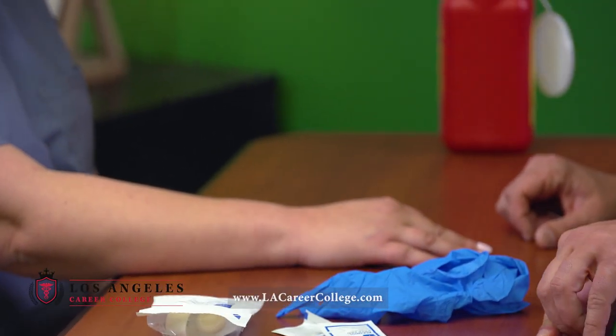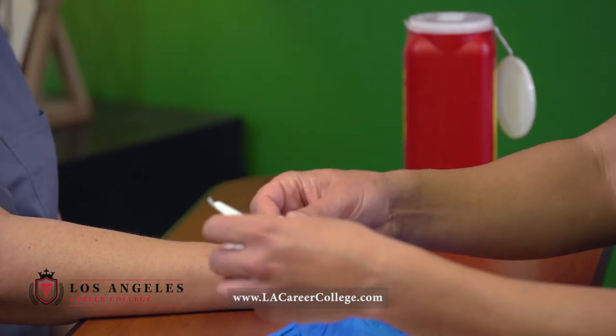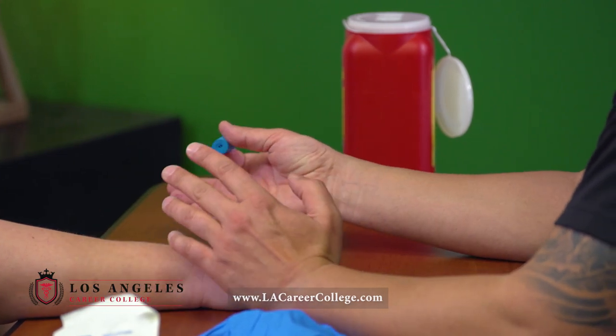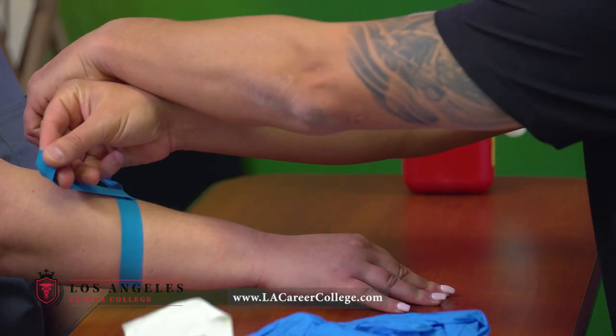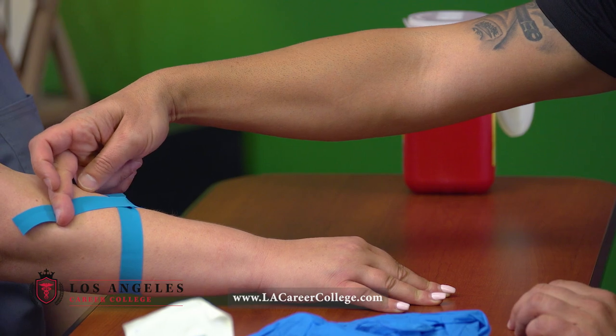So at this point in time, what I'm gonna do is I'm gonna go ahead and open up my IV start kit, take out my tourniquet, and look for veins. The idea is to look at both arms to find the best vein possible. So I'm gonna go ahead and tie the tourniquet. The correct way of tying a tourniquet is to put it over and make an X just like this.